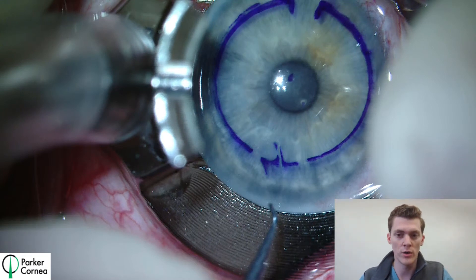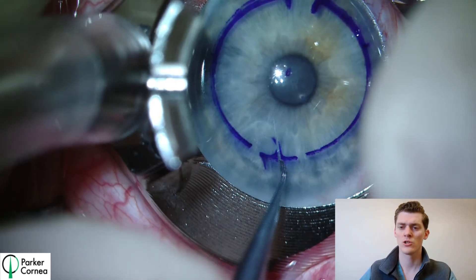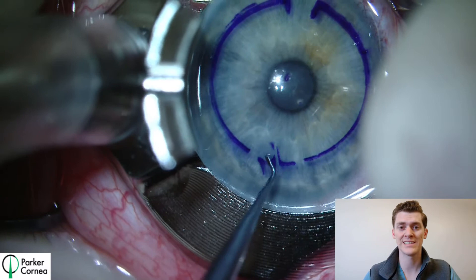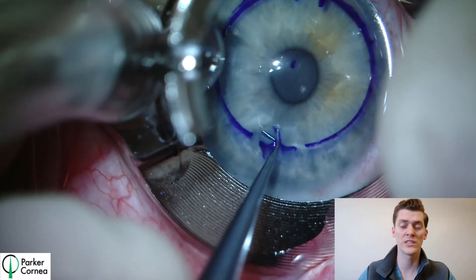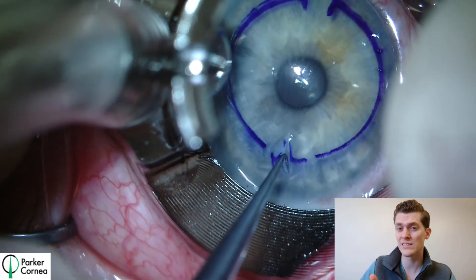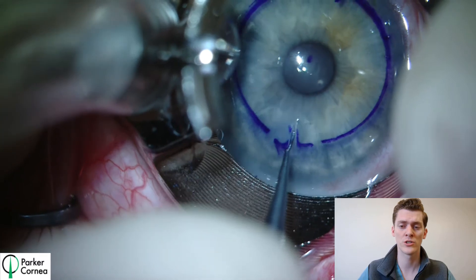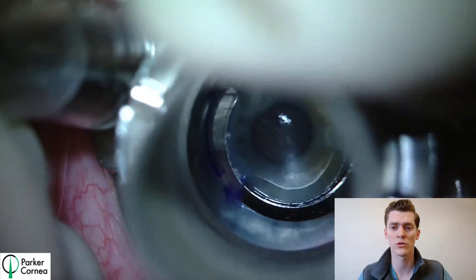Should we abort the case or continue going? To answer that question, we must determine if it's safe to proceed. So we reinsert the Sinske hook back into the incision and dissect a little bit of the stroma. We notice that the globe remains intact and no aqueous continues to leak from the wound. We therefore continue the operation and make the stromal pouch slightly more anterior, meaning not quite at the base. We're able to successfully do this and not interfere with the perforation, so we can then continue to dissect the semicircular channel using the corkscrew blade.